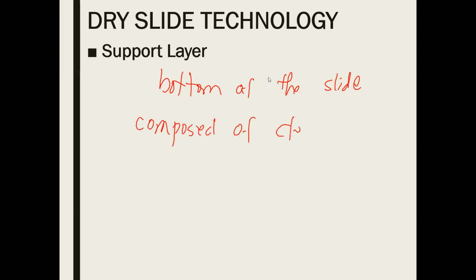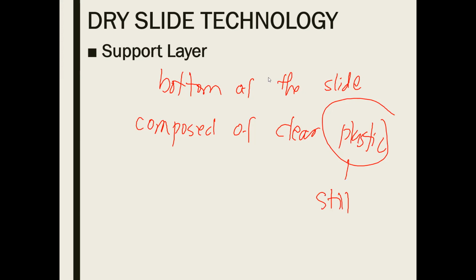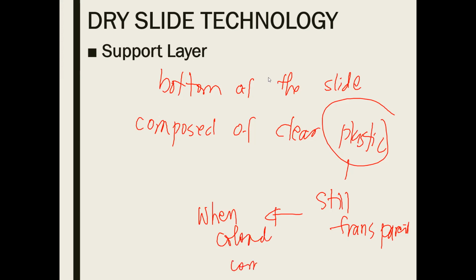And lastly, when we said support layer, it is found at the bottom of the slide, which is composed of clear plastic. Take note, guys, that this plastic is still transparent when the colored complex is measured. To give you an idea, ganito po yan. Yan.